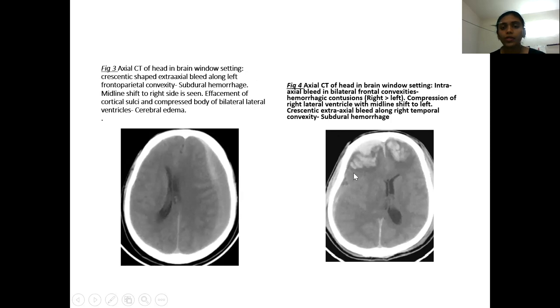Figure 4 includes bilateral frontal convexity intra-parenchymal hemorrhage.